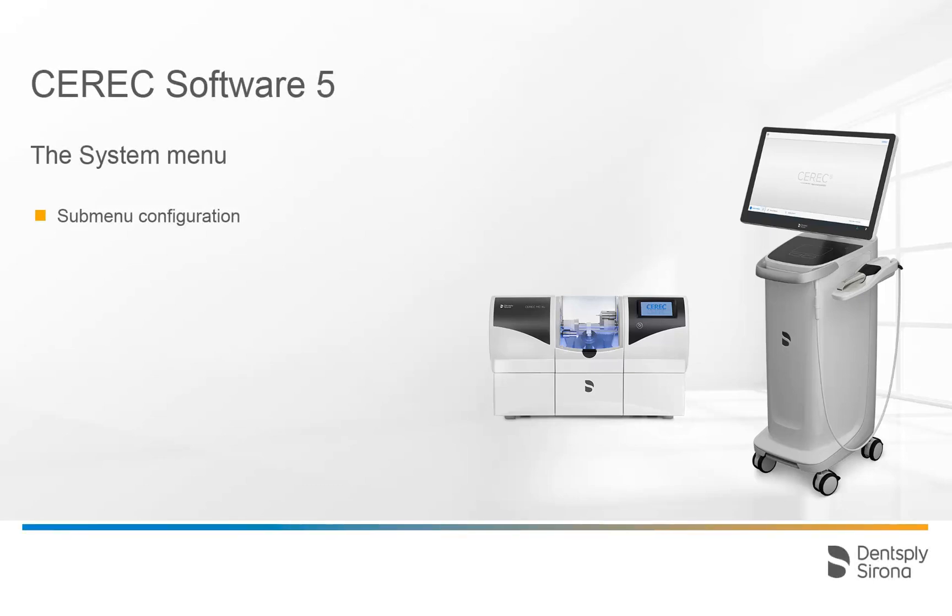Welcome to this video tutorial on the topic of the system menu. In this video we look at the system menu and go into more detail about the submenu configuration.